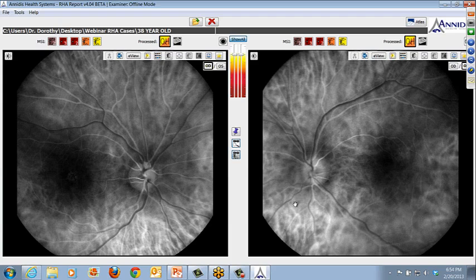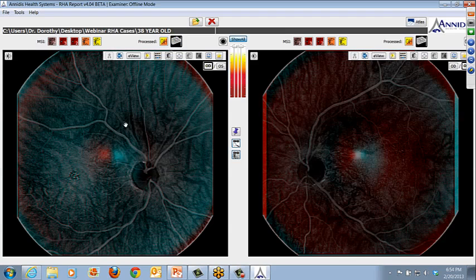And again, based on the level of oxyhemoglobin concentration in the vasculature of the retina and his stereo map, and I'm sure you're all sitting there with your glasses ready to go. But you can actually see that there's some sense of depth here, but really it's because the upper layers of the retina are clear, but there is no actual elevation.